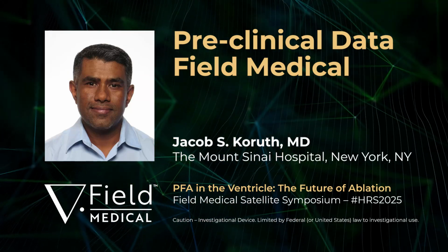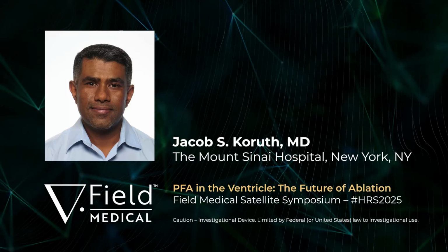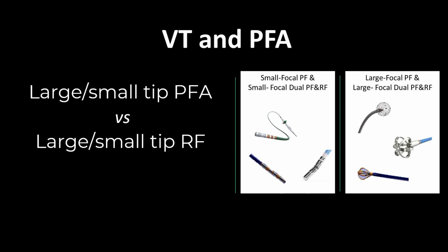All right, so my task is to go over some preclinical data with the field medical catheter. And I think as we delve into what the next catheter that's going to solve all our VT problems, you really need to look at what's out there. The way I think about catheters for VT is you have large focal tips and small focal tips with PFA. And then we have large focal tips with RFA and small focal tips with RF.